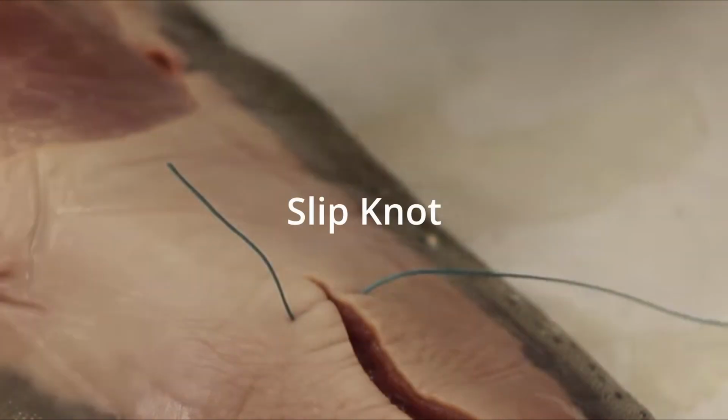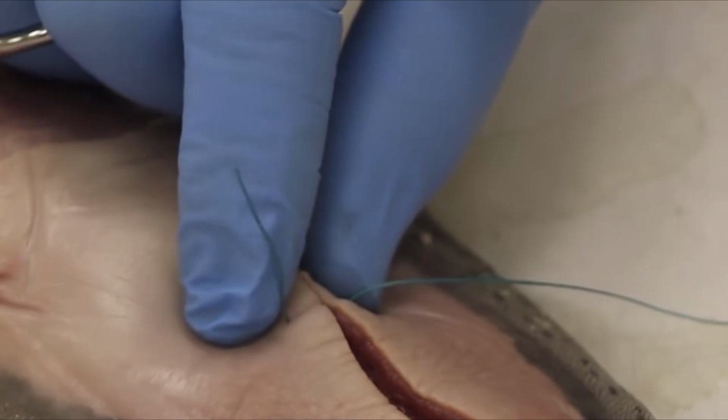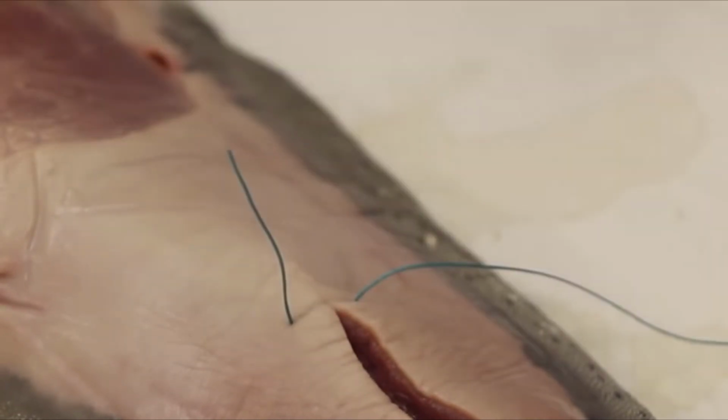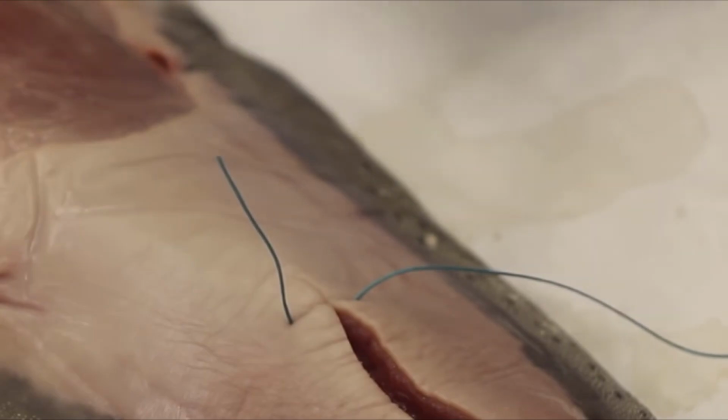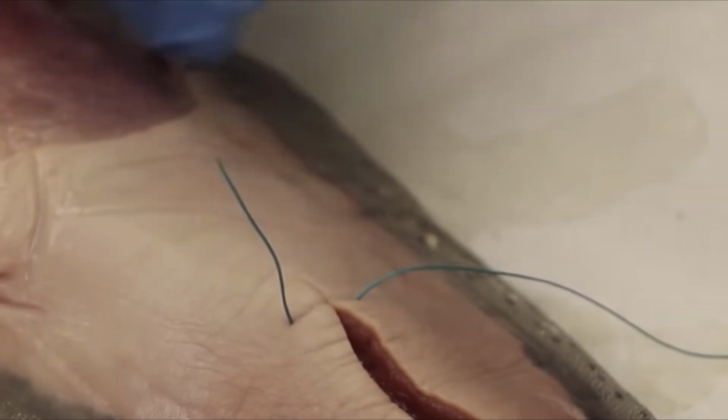Slip knot. The slip knot is a tension control knot that lets the stitch slide while you dial in the exact amount of approximation you want. It is used for skin and delicate edges, where over-tightening can strangulate tissue. The slip knot lets the edges come together with the right pressure, without crushing the skin. Start with an instrument tie.